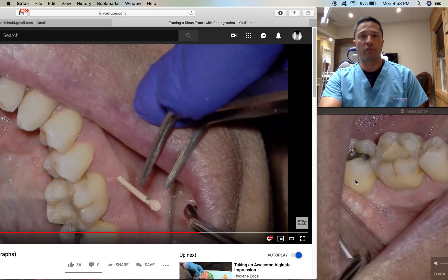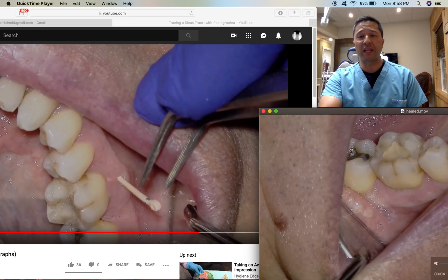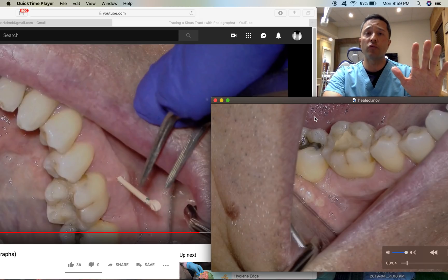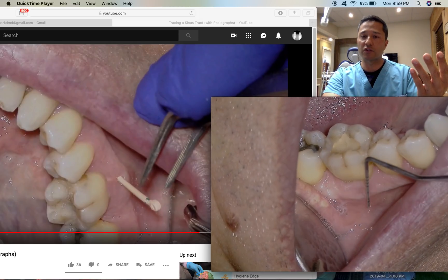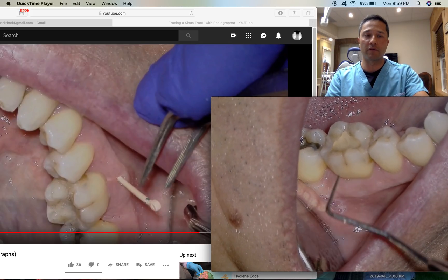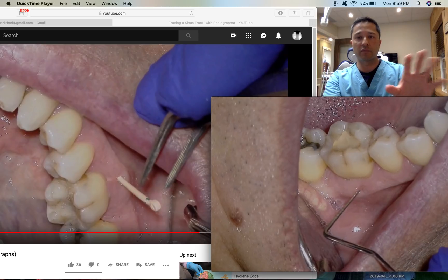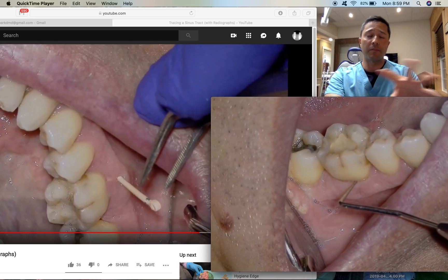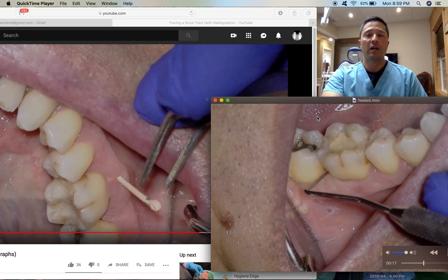The patient presented this evening just a few hours ago and we're all healed up. I don't see significant radiographic changes — our sinus tract is gone. You can compare it to the previous video. I'm using my perio probe just to feel around and confirm.